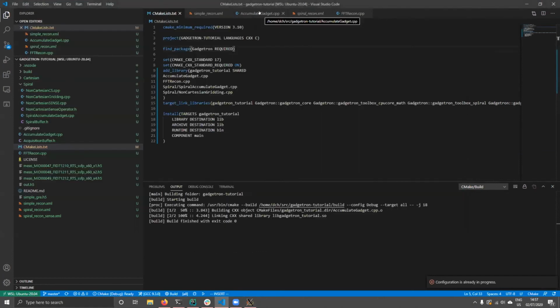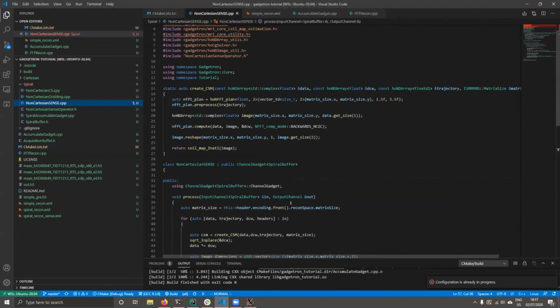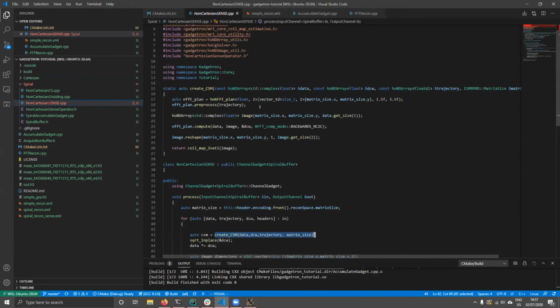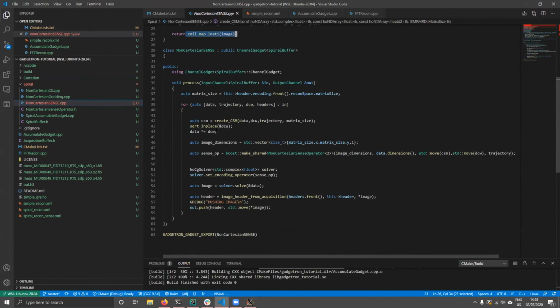But we're not satisfied with gridding. Gridding is boring, and SENSE is not that much slower, truth be told. So I also made a SENSE gadget. The flow is much the same. The one difference is we need some coil sensitivity maps. So I created a function that does the gridding from the other gadget, but just returns the coil map at the end because we need the coil sensitivities to do SENSE, and no one was nice enough to send them to us.